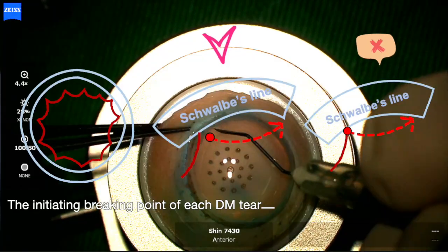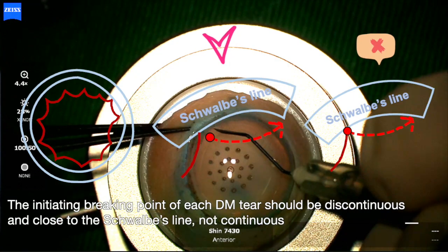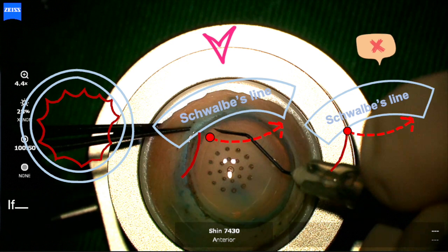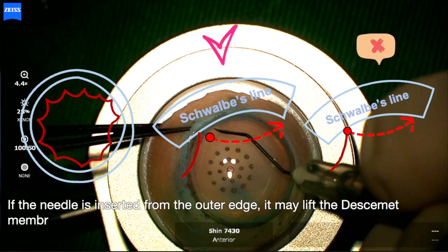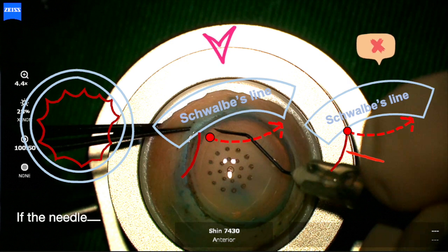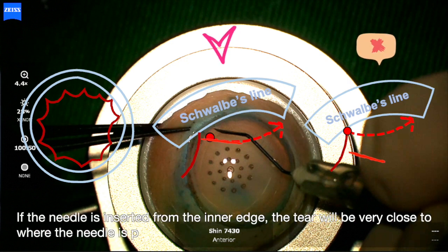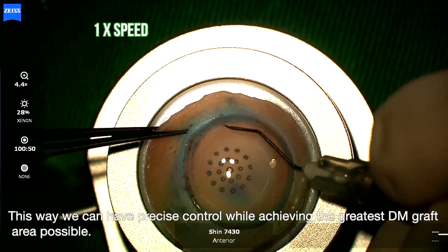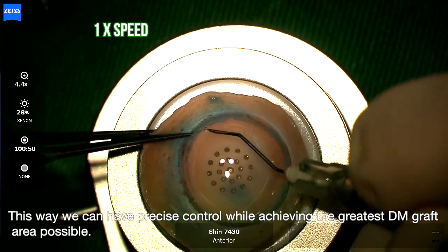The initiating breaking point of each tear should be discontinuous and close to Schwalbe's line, not continuous from the edge of the previous tear. If the needle is inserted from the outer edge, it may lift the Descemet membrane, causing the tear to be closer to the center, thereby reducing the remaining area. If the needle is inserted from the inner edge, the tear will be very close to where the needle is positioned. This way, we can have precise control while achieving the greatest graft area possible.